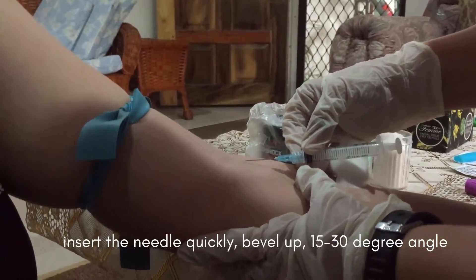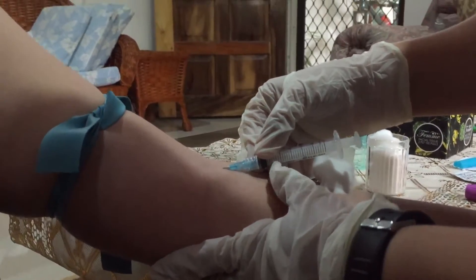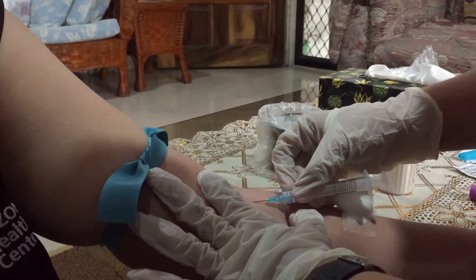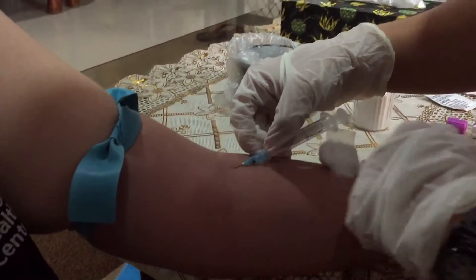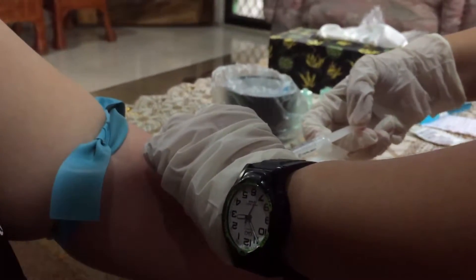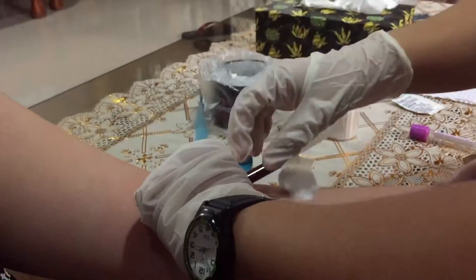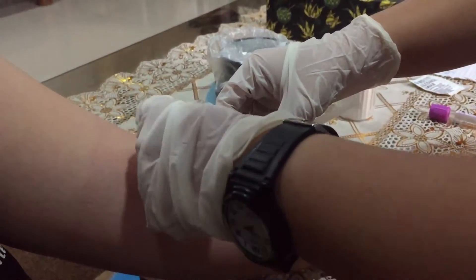Ma'am, I'll be inserting the needle now. If you don't hit the vein at first, stay calm and trust in your skills. Remember to remove the tourniquet before withdrawing the needle.